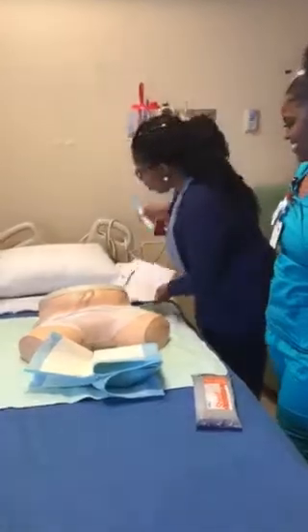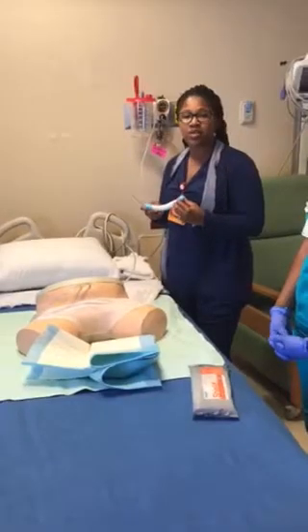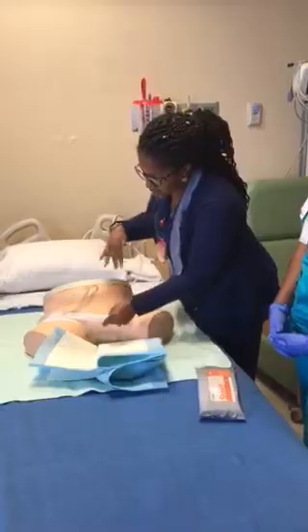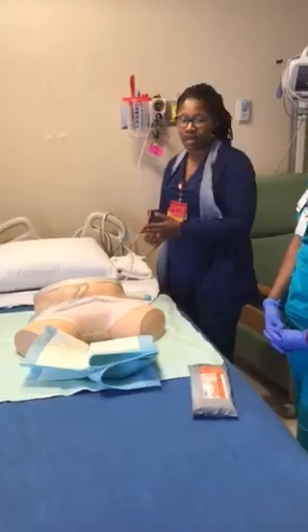The first thing we want to do with the PureWick is make sure that your patient meets criteria. If the patient's having a lot of incontinent stools, they're not going to be a candidate for it. If the area is not intact — if the skin is red, if it's irritated — they're not going to be a candidate for it either.